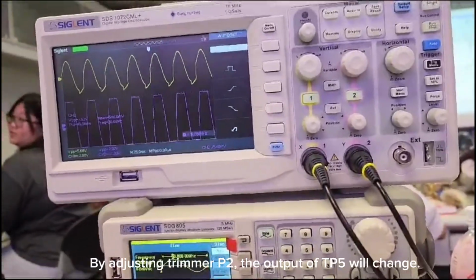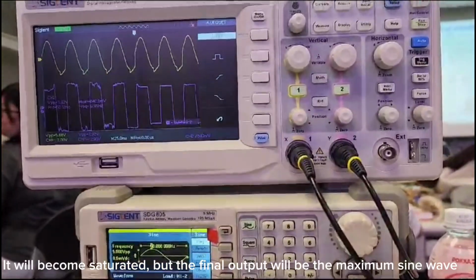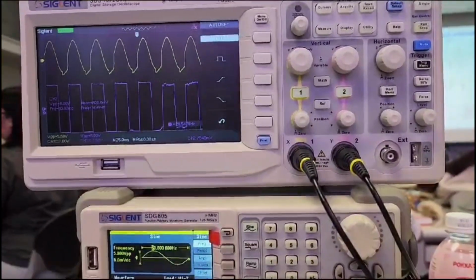By adjusting trimmer P2, the output of TP5 will change. It will become saturated, but the final output will be the maximum sine wave attained without being saturated.